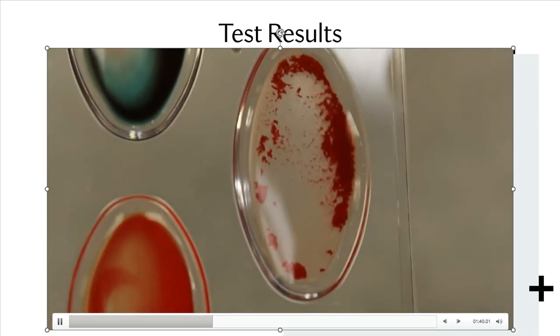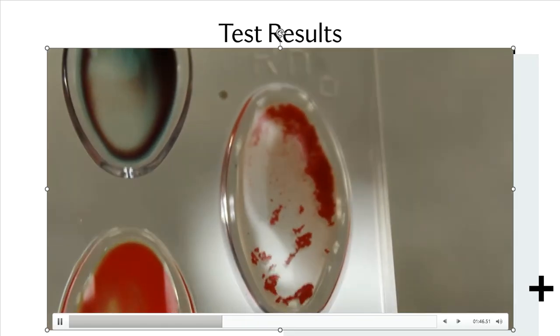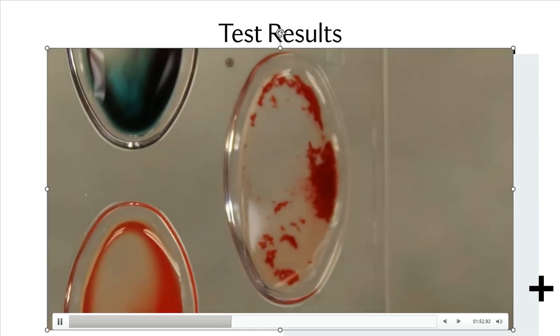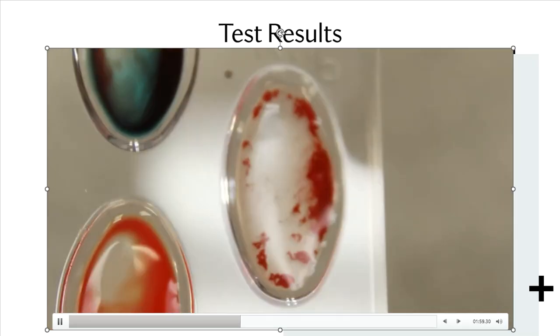And keep in mind that if they gave me the wrong blood, this is what would go on inside of my body as my body would try to fight all of that new incoming blood that doesn't match mine or is not compatible with mine. This begins to happen throughout, head to toe. So this is agglutination, and that is what that is supposed to look like.